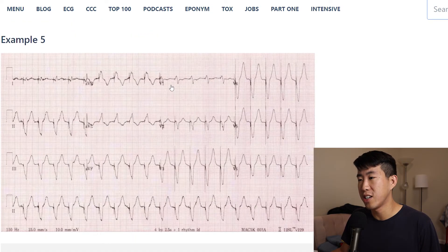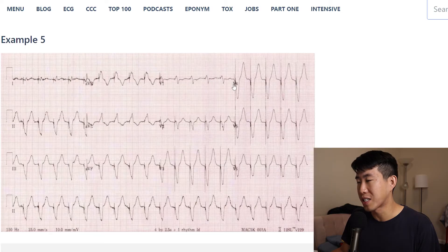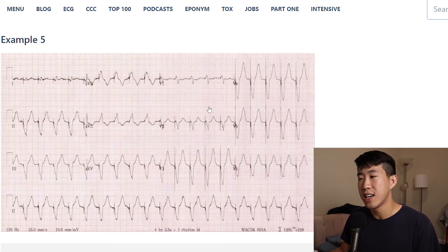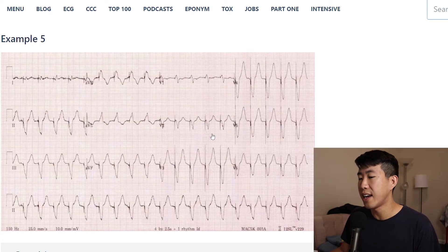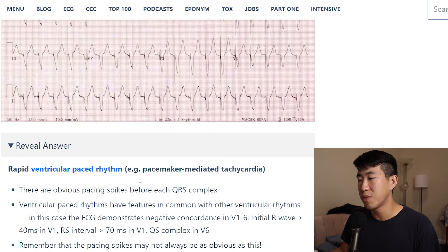One last example: this patient has a wide complex tachycardia, but clearly there's something going on right before all of the QRS complexes — that's a pacer spike. Remember that pacemaker mediated tachycardia is another cause of regular wide complex tachycardia. This patient is ventricular paced, producing wide bizarre QRS complexes from the ventricle — this is a ventricular paced rhythm, pacemaker mediated tachycardia.